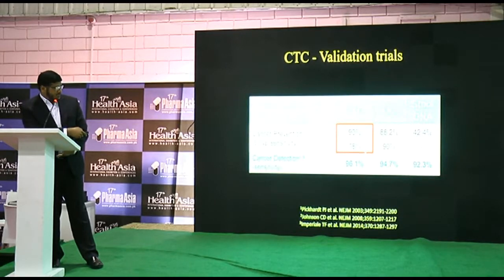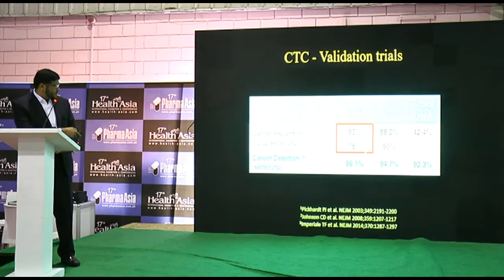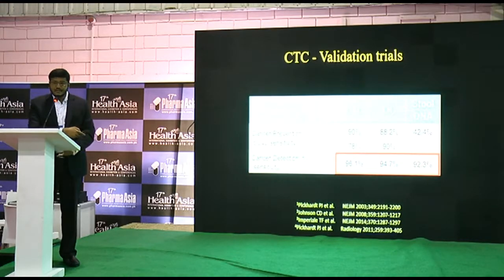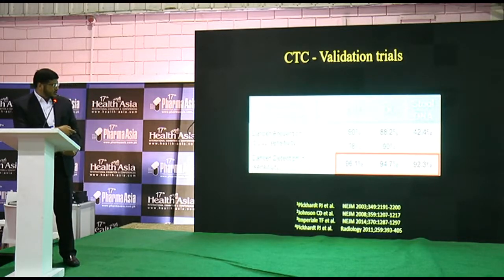Various studies in cancer prevention and cancer detection suggest the sensitivity of CTC is around 90% for polyps of size 10 millimeters, while it is a little bit lower, 78%, in comparison to optical colonoscopy if the polyp size is small. On the other hand, for cancer detection, CTC and optical colonoscopy are comparable, as both show a higher rate of detection in case of cancer.